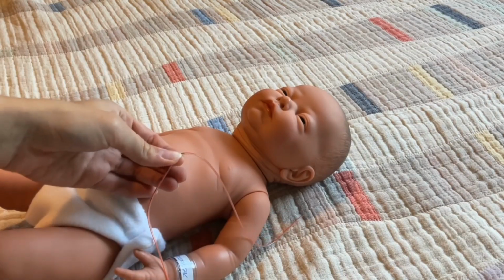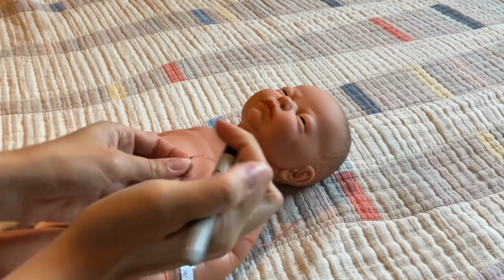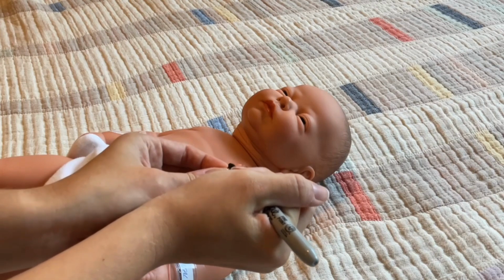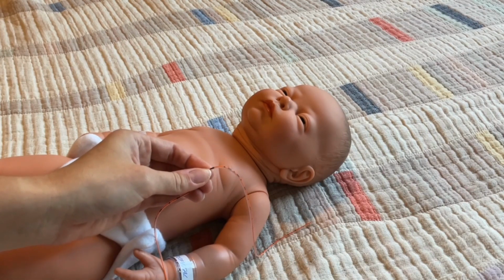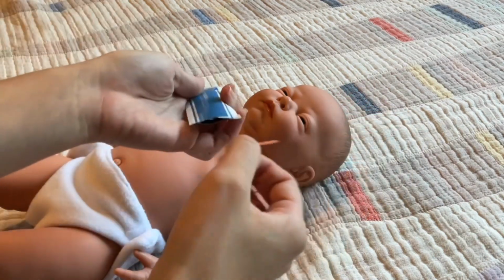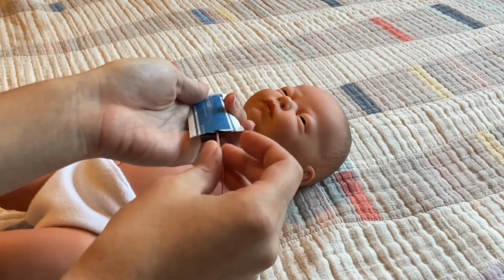Then you're going to take your Sharpie and mark the length that you want the tube to go to. That way, when you're inserting, you know when to stop. Take your lubricant and put the tip of the tube into the lubricant. This will help the tube go down the baby's nostril.